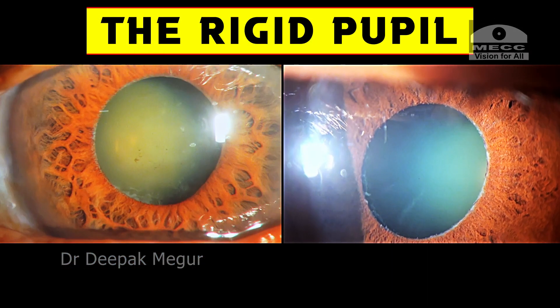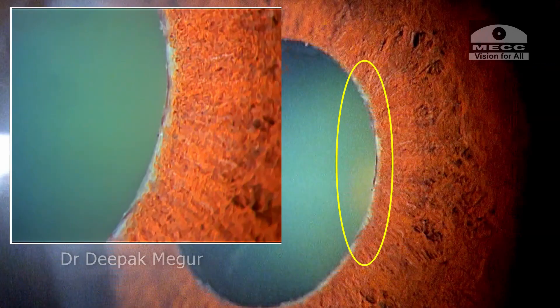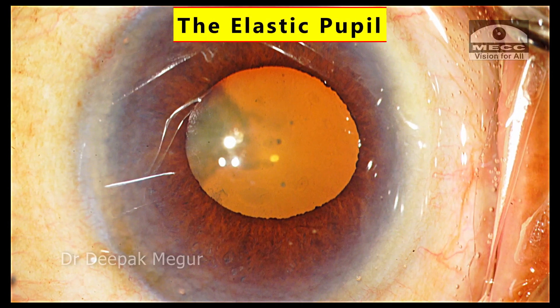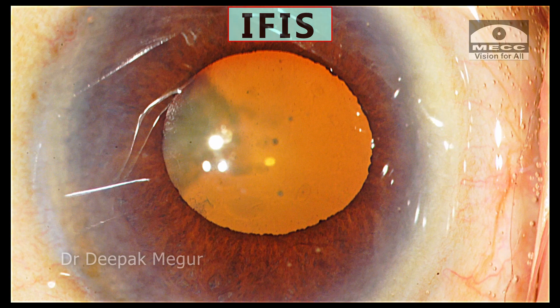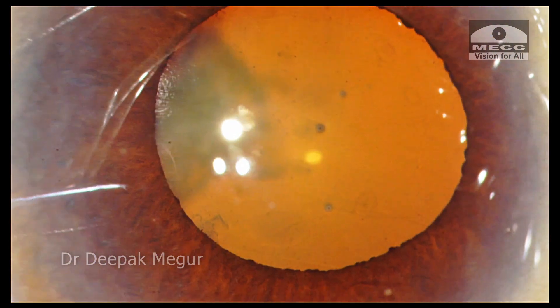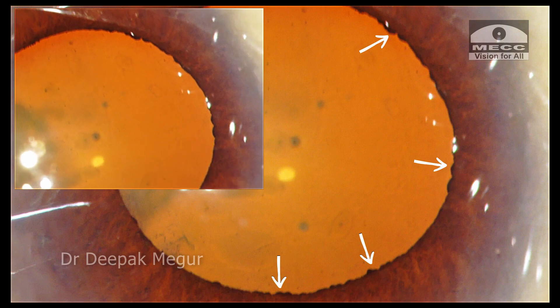These two pupils are rigid pupils. They arise with pseudo-exfoliation and we can see the total lack of pupillary ruff and there is sphincter atrophy. On the other hand, this is an elastic variant of the small pupil, most likely a potential case of IFIS. The patient is on Tamsulosin. The pupillary ruff is intact and there is no sphincter atrophy seen.